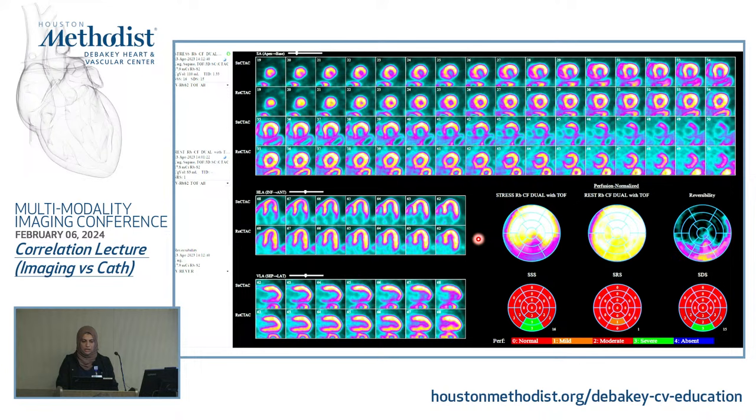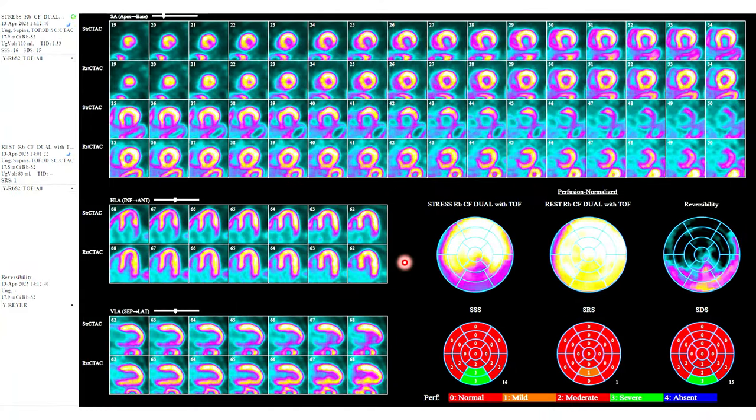So as part of his ischemic workup in a patient with a very significant story and history, he gets a cardiac PET. These are our resting, these are our static images. Just to orient, the top is our stress, and the bottom is our rest portion. Victor, do you want to help me figure out the perfusion defect?